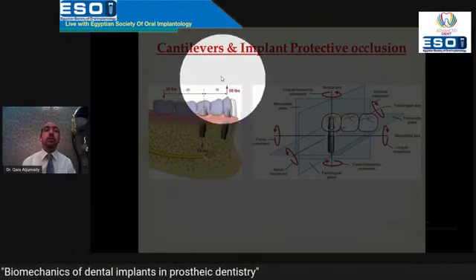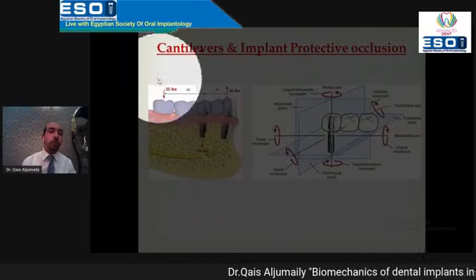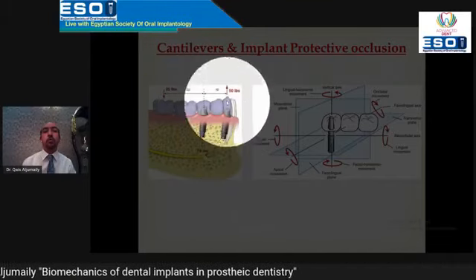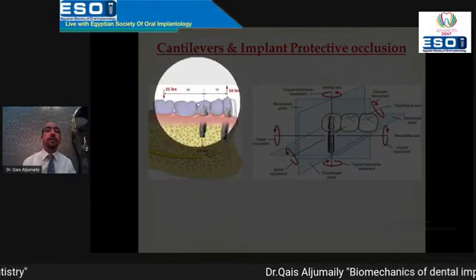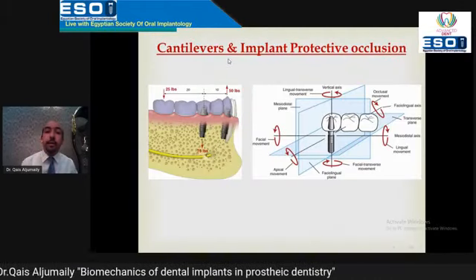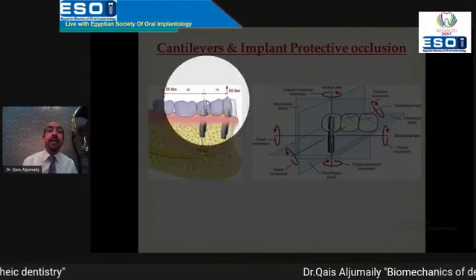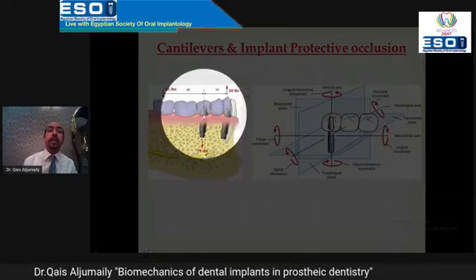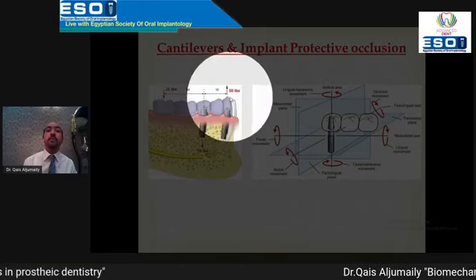In an opposite direction. So the force here is from occlusal to gingival, while here on the first abutment it will be from gingival to occlusal. It is double. Why? Because the distance here is double of this distance. It's 50 pounds. And the bigger problem is not only here. The bigger problem is here. The second abutment will receive the total amount of the force. This is 25 and this 50.